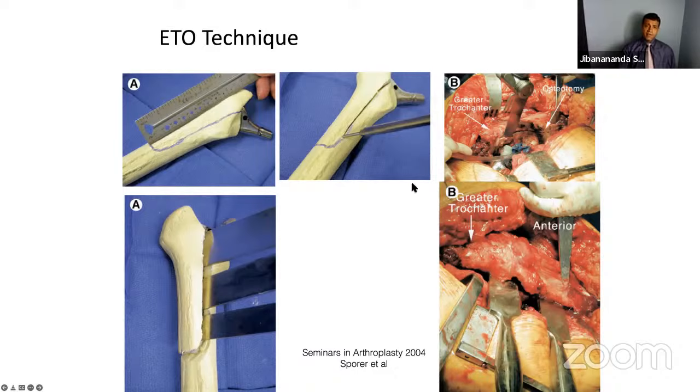And then to lift the osteotome fragment, I use stacking the osteotomes, like it's done. You have a different level. I usually overlap it a little bit so that ultimately it lifts up. Make sure you finish the anterior cut on the trochanter.